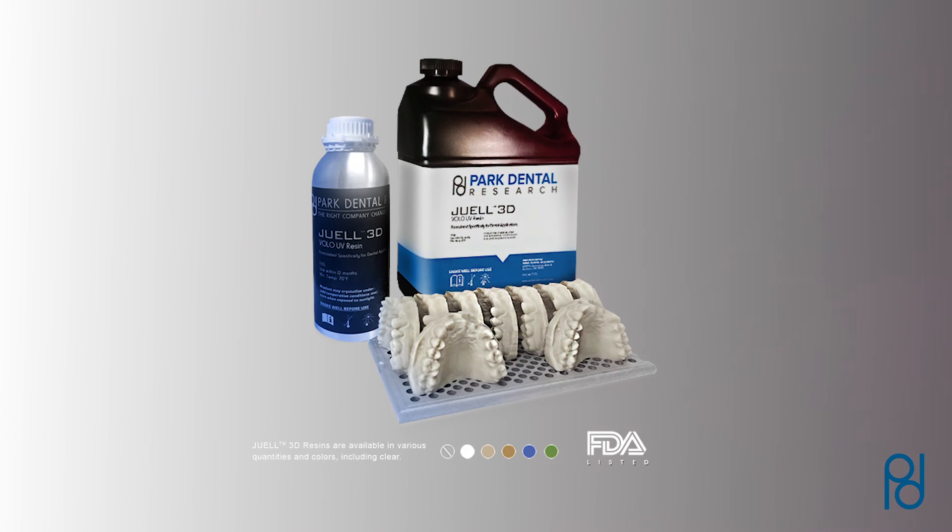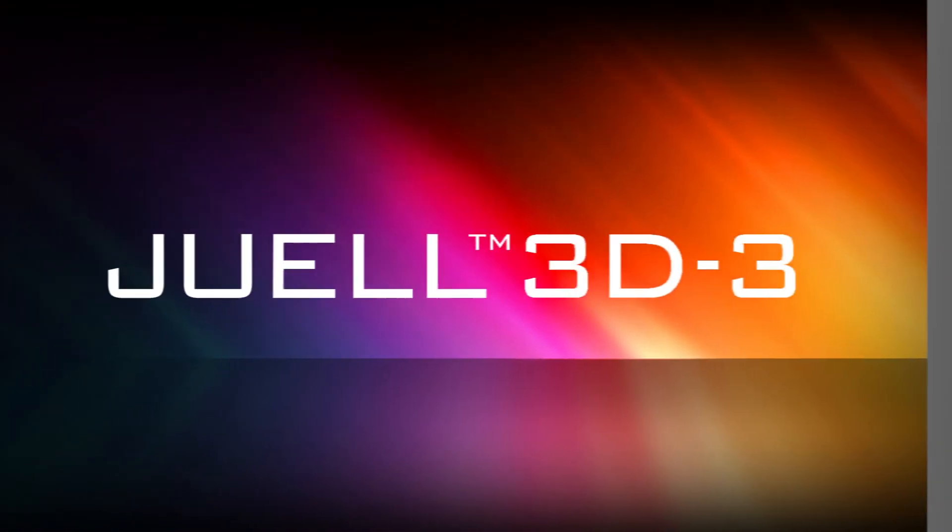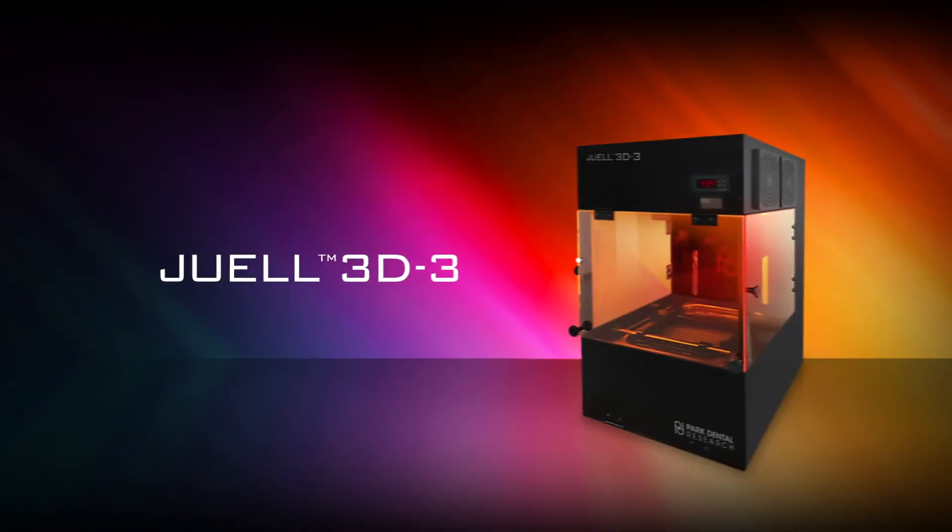Available in various quantities and colors, including clear. Get the innovative JUELL 3D-3 printer, resins, and accessories by Park Dental Research today. Order online at JUELL3D.com.